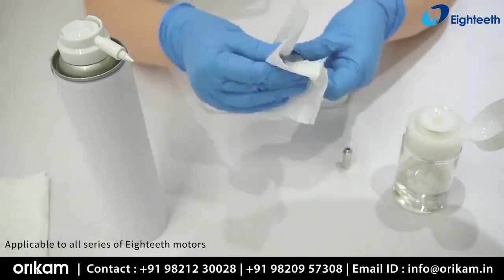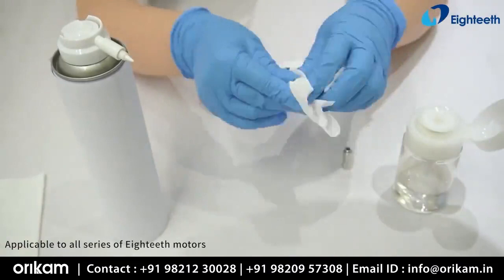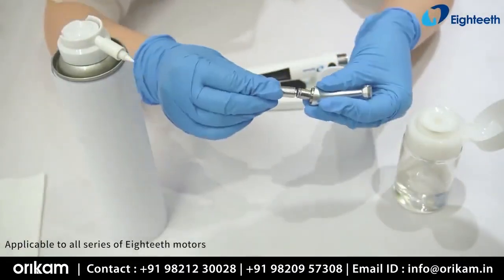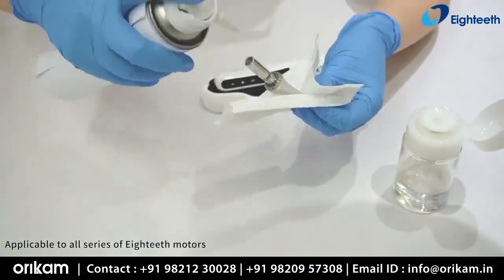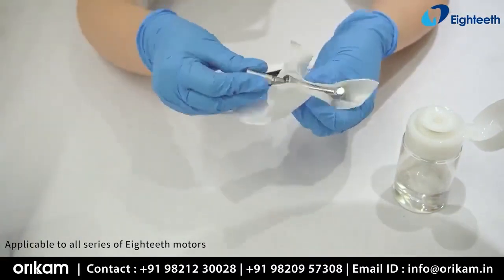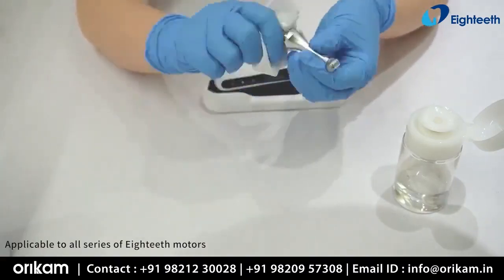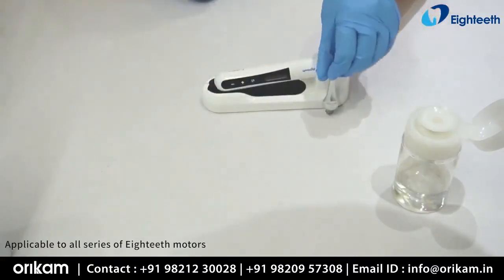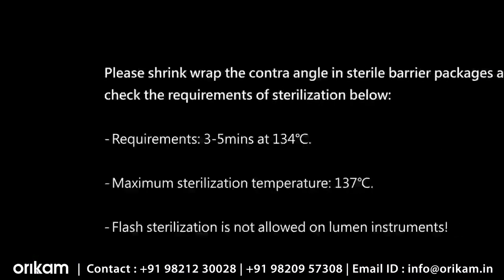Detach the contra angle from the handpiece and clean the surface. Connect the nozzle to the contra angle and make sure it fits well. Cover the contra angle with a tissue paper and, while holding the lubricant upright, spray for 2 to 3 seconds with full pressure. Keep wiping off the debris that oozes out of the shank site and repeat until clear oil comes out. Wipe off excess oil from the surface and position the contra angle vertically for 2 to 3 hours to allow excess oil to drain out.